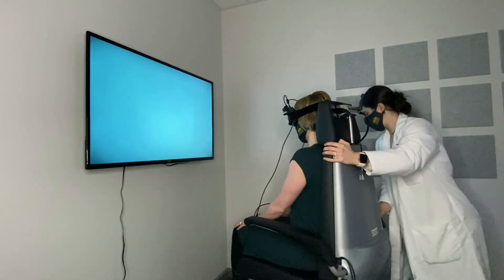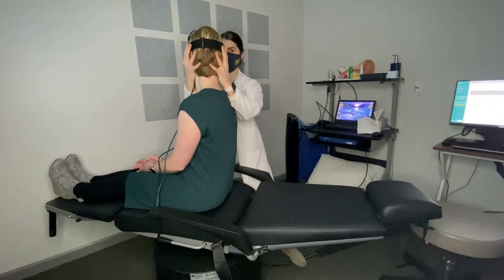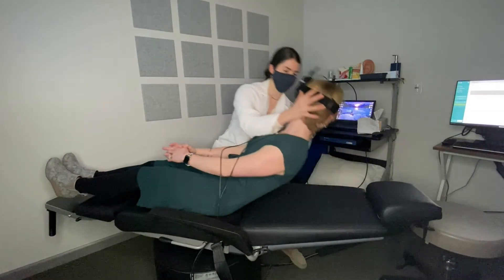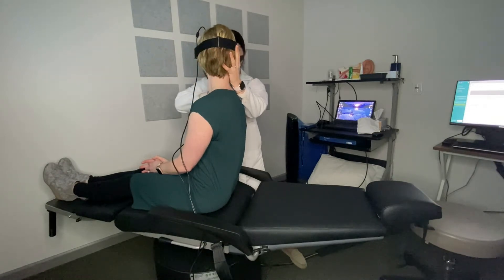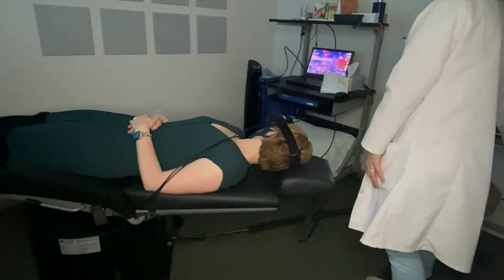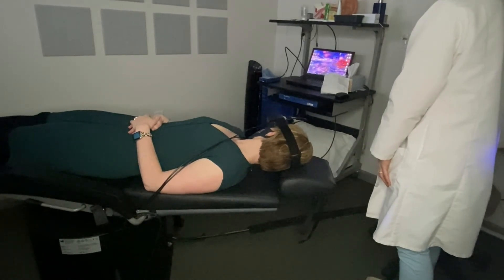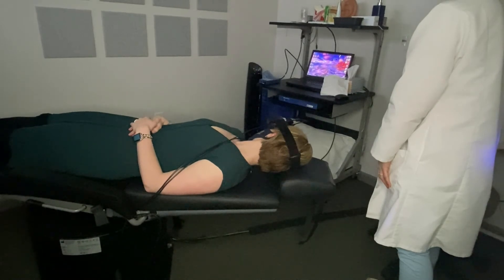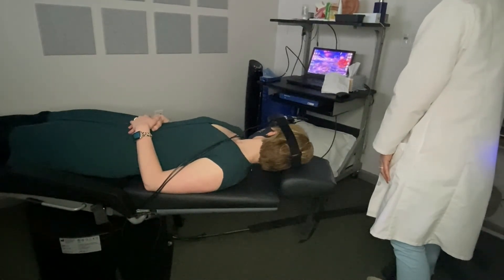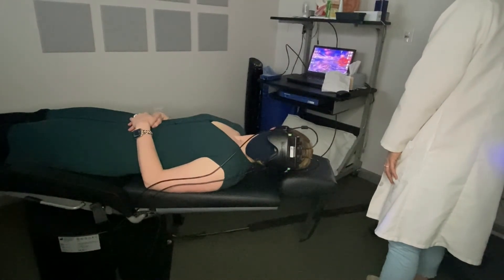What Rachel's doing now is just getting ready to reposition the chair, and then we'll go on to the next part, which is positionals. This is the first part of positionals — it's called Dix-Hallpike. We're monitoring for benign paroxysmal positional vertigo. We'll turn the head to one side and lay down, and then come back up. We would repeat this on the other side. This is the second part of the positional testing — we'll have the patient turn their head to the right, basically flexing their neck, putting the right ear down towards the ground. There is some visual stimulus that will pop up occasionally, and we'll just have the patient focus on that. We do this in several different positions.